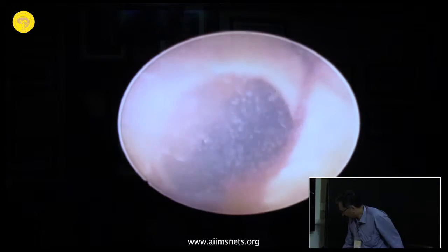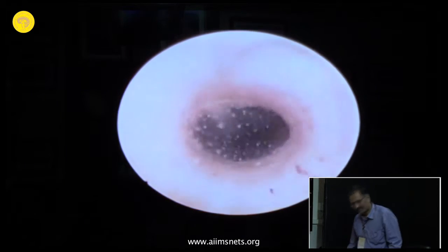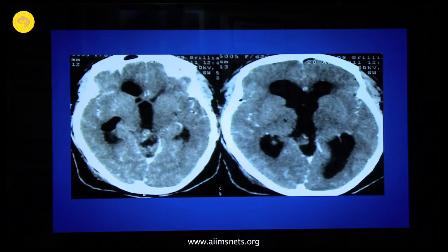Now when you are coming out, you can see all the crystals are all over. So this is the post-op image, but this was a spontaneous double fenestration. I didn't plan the lower part of it. I was just lucky, you know, beginner's luck.